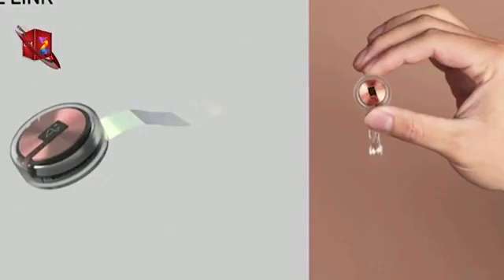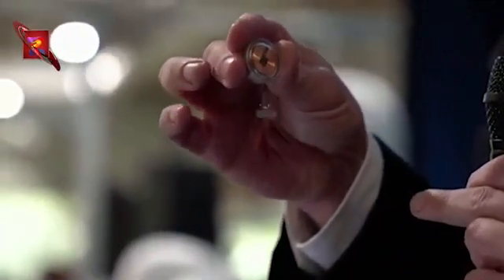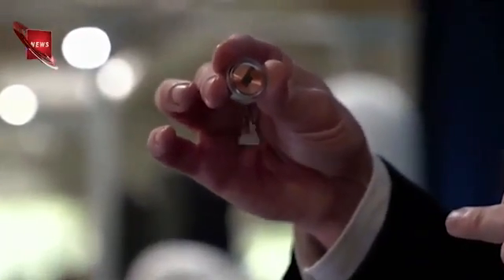So, yeah, this is our little device. That thing at the bottom is just to hold the threads in place, because they're just like little fine wires.